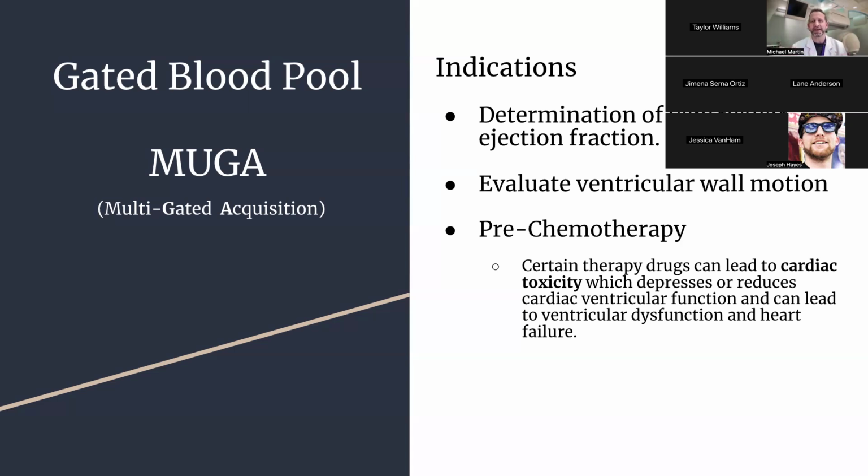And like you guys know by now, I've heard doctors call nuclear medicine, they flip the N and the U and they call it unclear medicine. Because again, we're gathering counts and points of data, and so we don't get these really high resolution images, whereas on an echo, you do get very high resolution images. And so you tend to get a little more accurate EF.